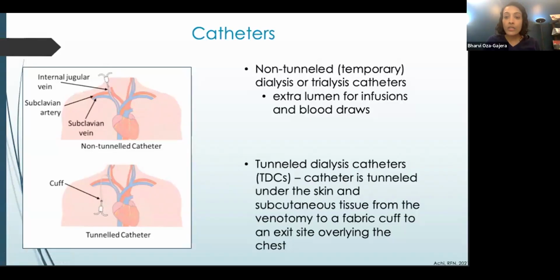And I do want to point out here that nomenclature is actually very important. We very often see people labeling catheters as a subclavian catheter. That is erroneous, and it can actually lead to some negative ramifications for the patient. Almost all of these, I would say 95% of them, are in the IJ. They're in the internal jugular vein, sometimes in the external jugular, but that will be very clearly identified in the procedure report.